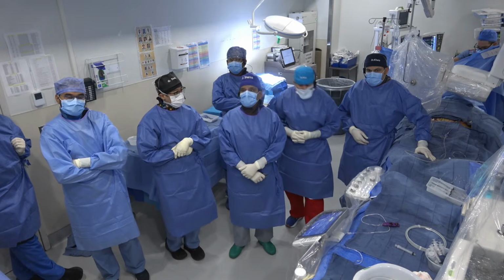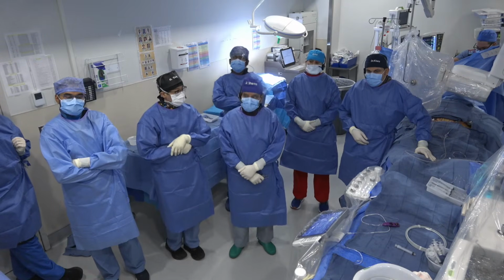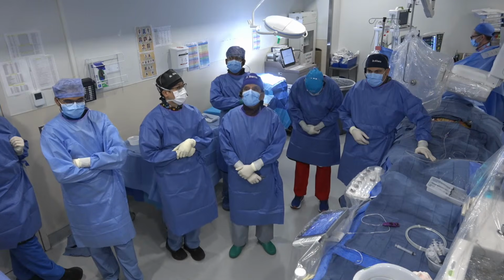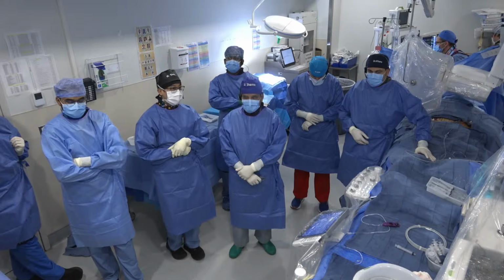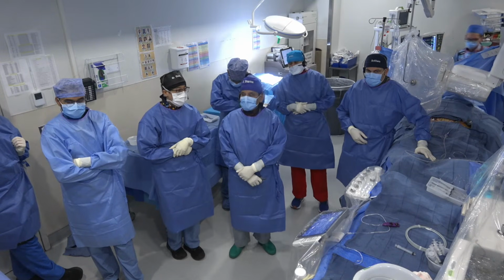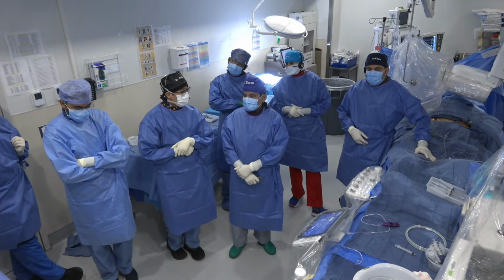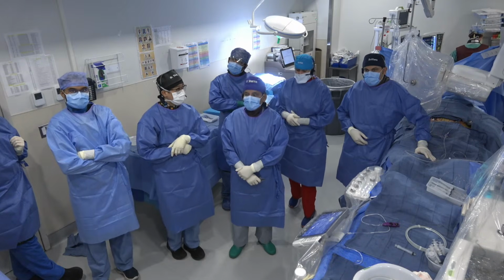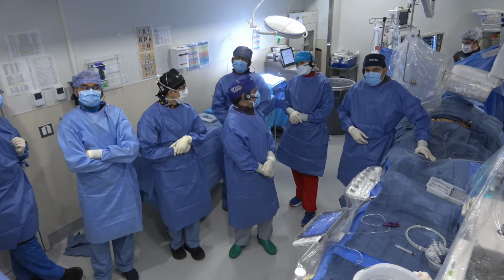I mean, you can. I think the risk will be root injury, just like you would have with a 26 SAPIEN to start with. It's a trade-off. Like I said, it's a 26 non-compliant balloon, so you cannot see the pressure. You would probably have to do it under TEE to make sure the root is not being overstretched. But either way, remember, a nitinol frame is not a cobalt-chromium frame. A nitinol frame will recoil. It has memory, so it conforms to native anatomy. Whatever you stretch beyond, it'll come back and be reduced. So now the question is, where are you going to place this second valve?